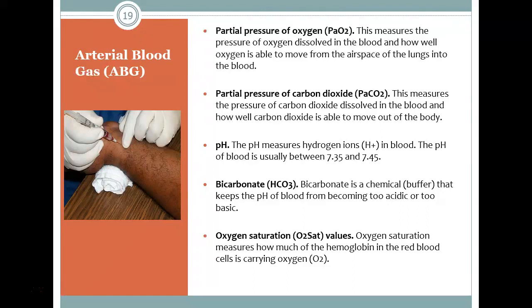And then finally, our SpO2, also known as O2 sats, or oxygen saturation. What we're looking at with this is how much of the hemoglobin in our red blood cells is able to carry oxygen.